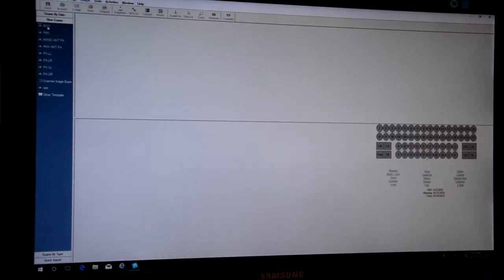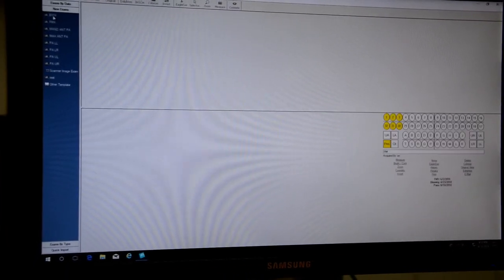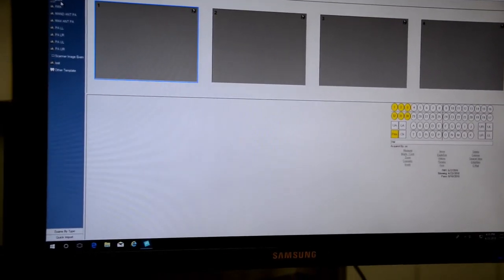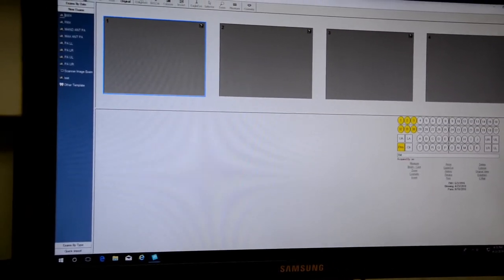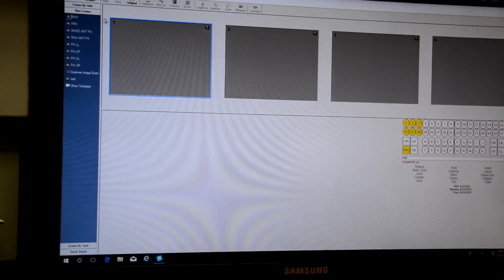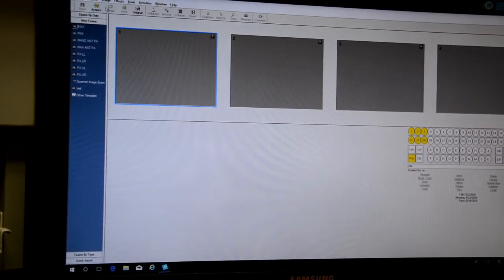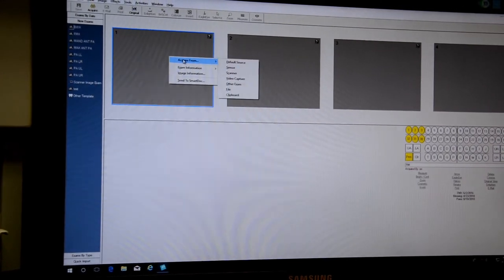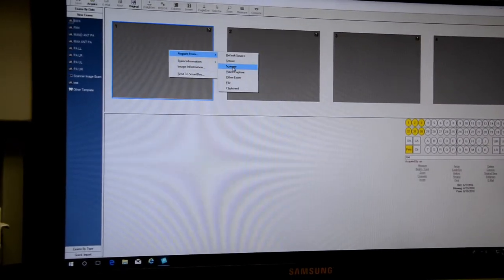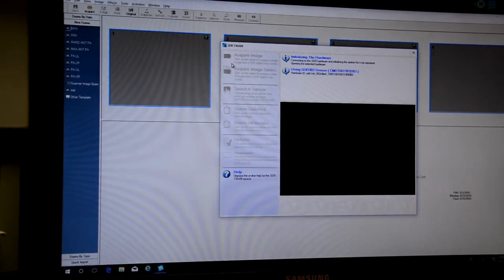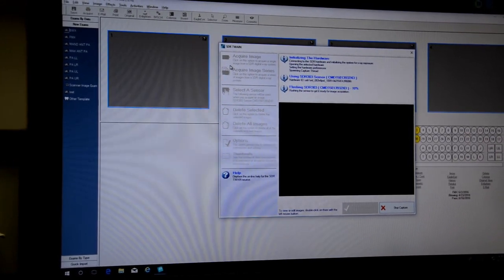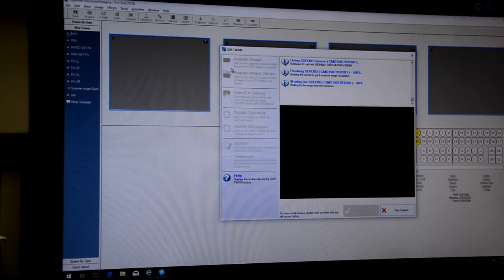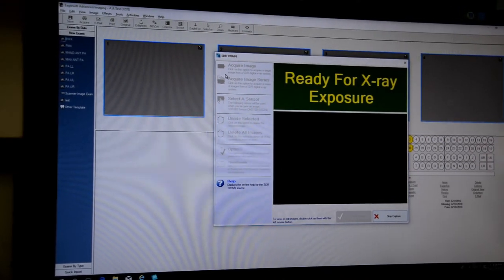So if we wanted to click our bite wing series. We'll click our bite wing button over here. So you just closed out the other one. Correct. And I can because the default source has been selected, I can either click the acquire image up here at the top, or I can right click and acquire from the default source which is also the scanner. Select that. It will initialize the sensor. Once it turns green it is ready for exposure.